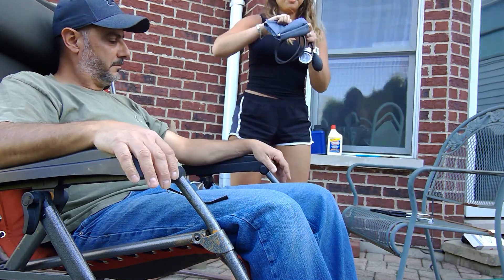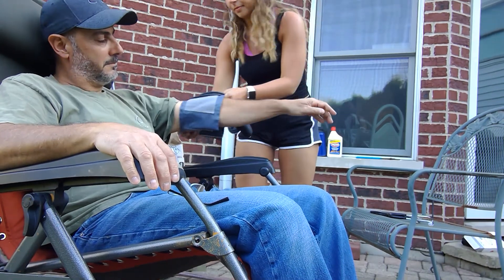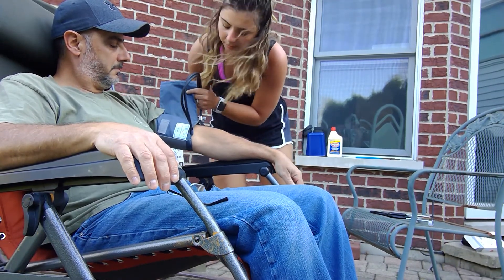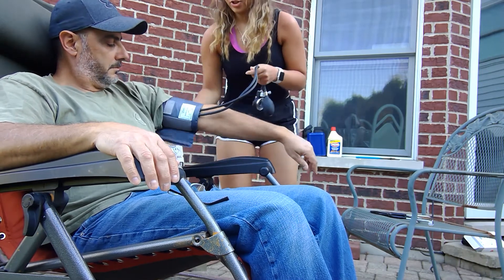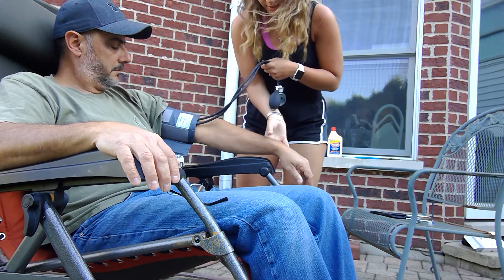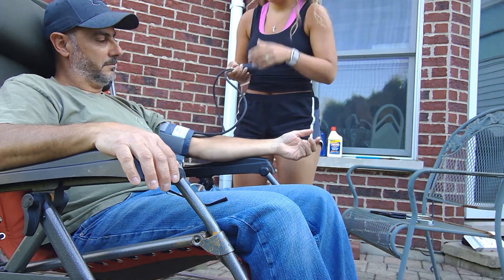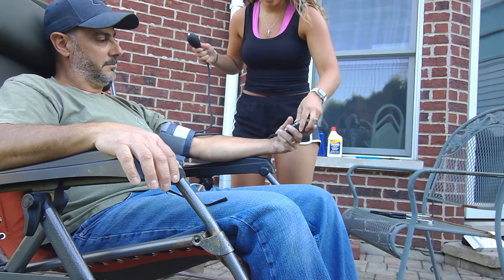I will start by putting this onto his left arm, making sure that it's tight enough but that I can still fit two fingers in it. I'll ask you to put your arm down, and I'm going to ask you to not talk or move while I do this.